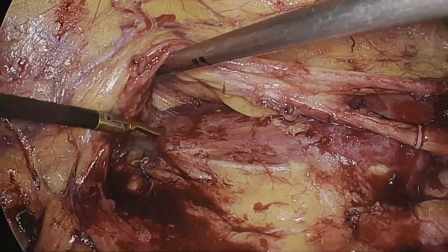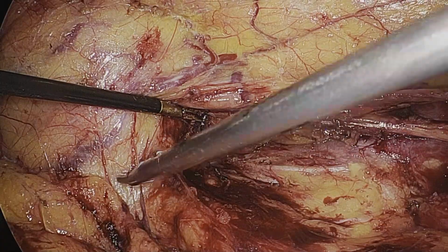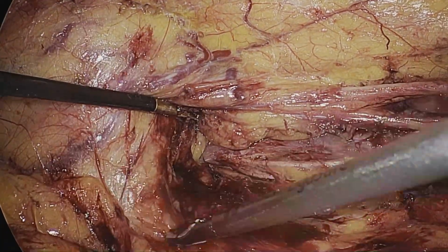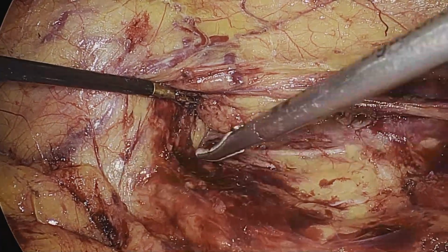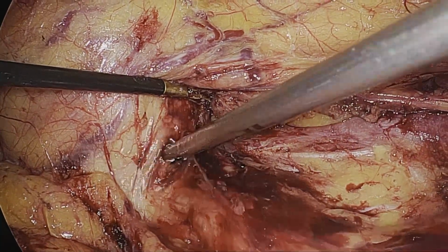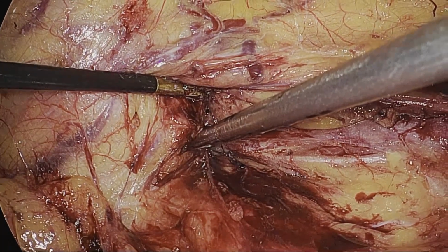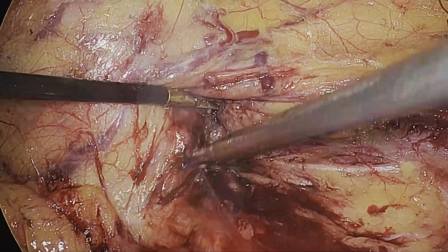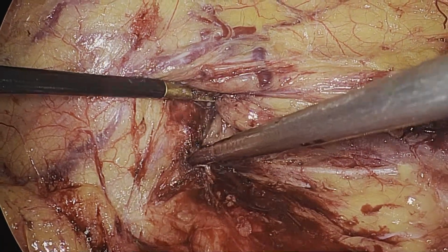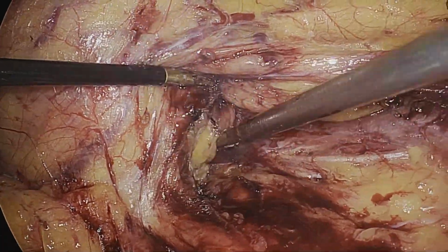Now we are approaching towards the hilum, and to reach the hilum, we typically follow the gonadal vein, which drains into the renal vein, and this helps make the dissection easy. We had preemptively studied the CT scan with contrast thoroughly. This patient has a single renal vein and a single renal artery.